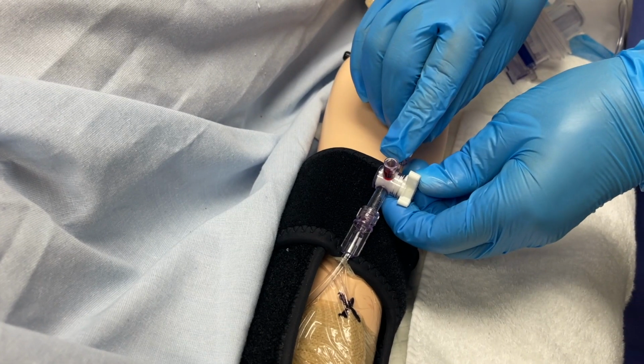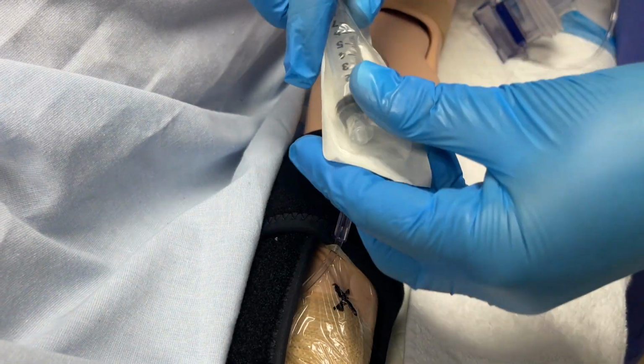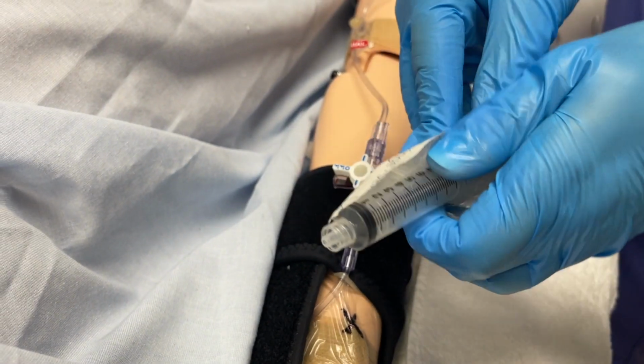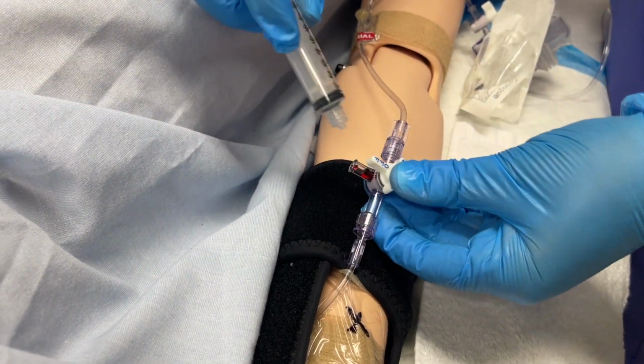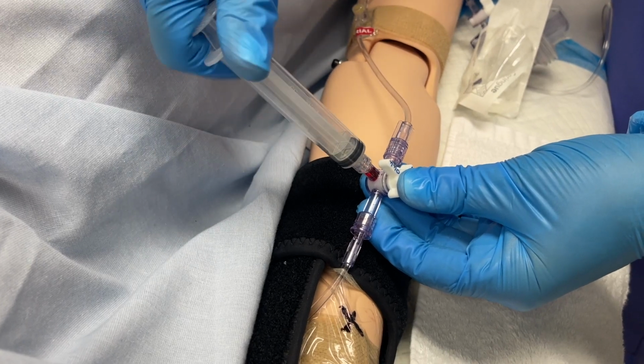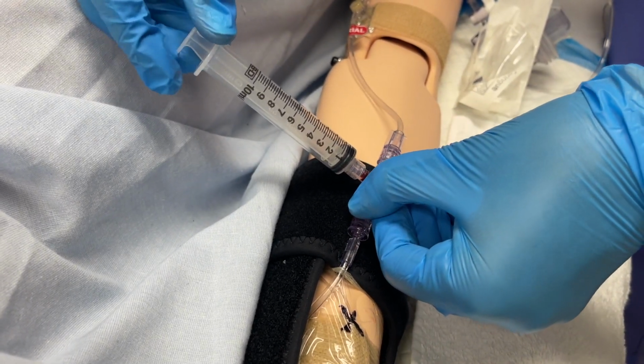Now I will show you an additional way in order to clean out that port. Attach an empty sterile 10 milliliter syringe to the port designated for air on the stopcock. Turn the stopcock off to the patient towards the access site.